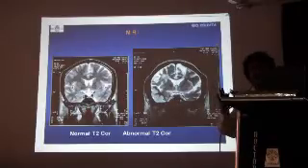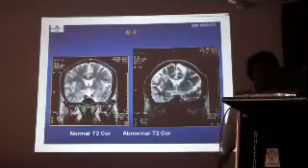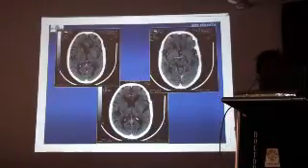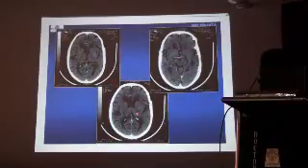But still, I am not happy with this one. I will opt for a different option. Okay. Now, there is an example. This is an example of multiple small infarcts in the paraventricular area. Small ones.